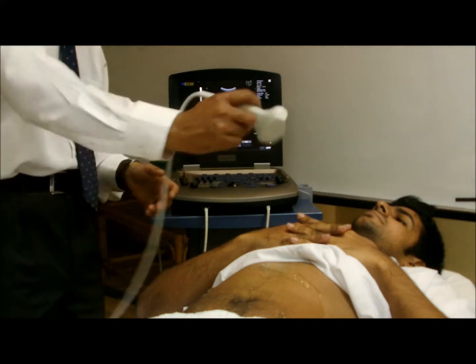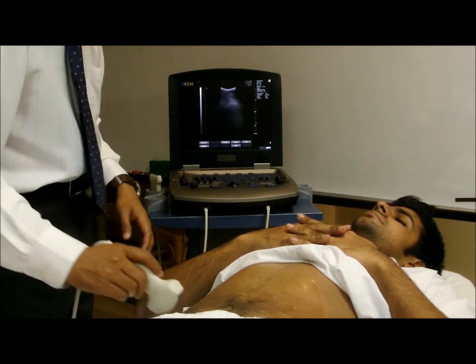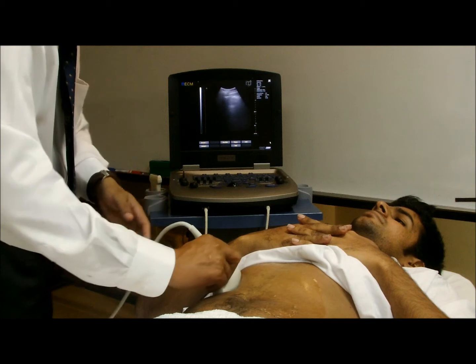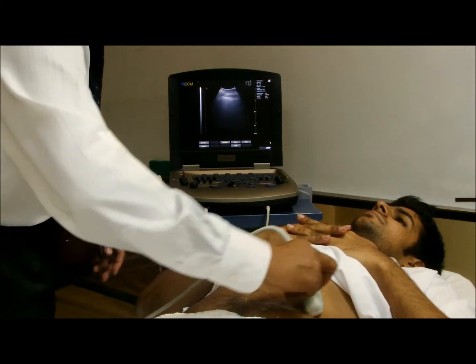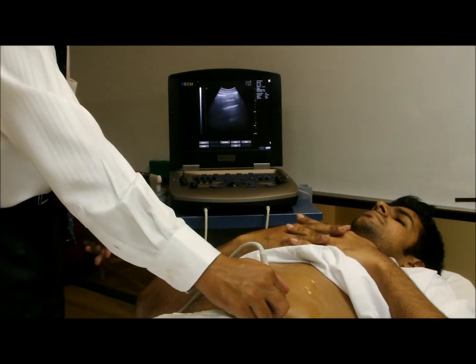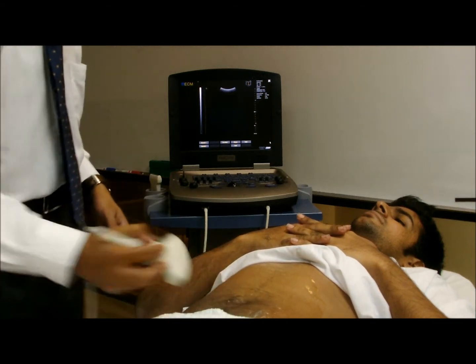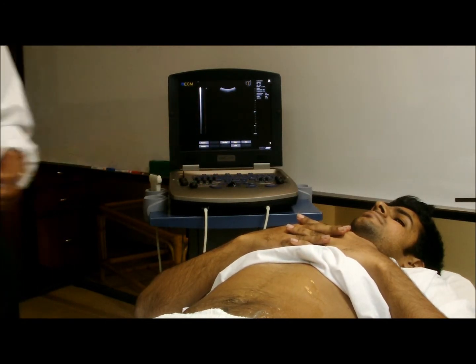This is small bowel. For large bowel, what you need to do is just follow the ascending colon, like that, and twist into transverse position throughout the transverse colon, and coming down through the descending colon, and you twist it and follow the pathway of the sigmoid colon until you reach the rectum. So that's for small bowel obstruction and large bowel obstruction.